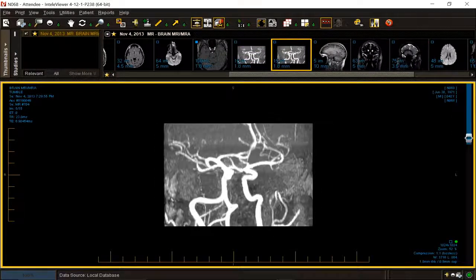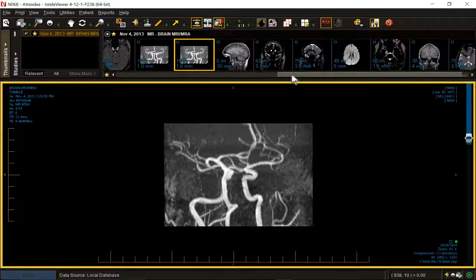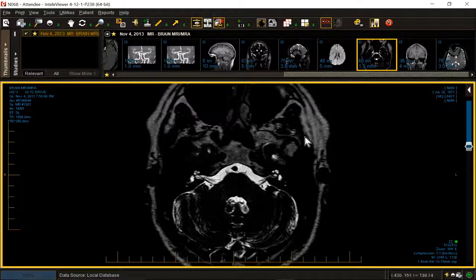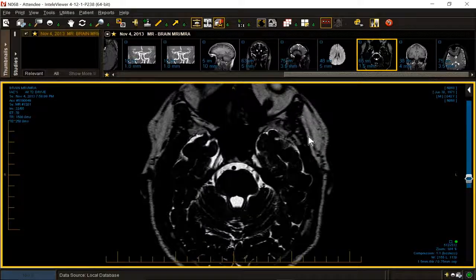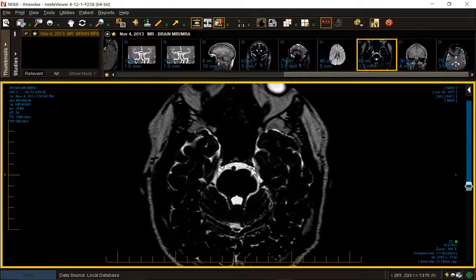Quick look at our MIP images. So in this case, let's turn our attention to the axial high-resolution 1.5 millimeter cisternogram. And we now beautifully see our fifth nerves. We see our sixth nerve headed right towards Dorello's Canal. There's Meckel's Cave.